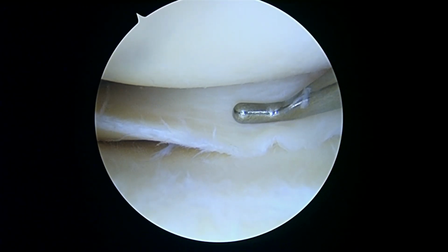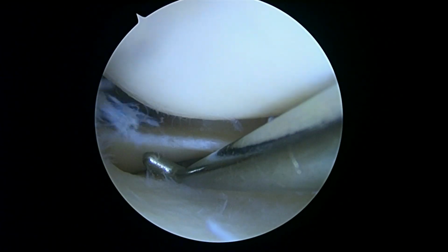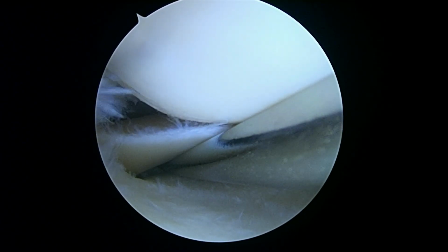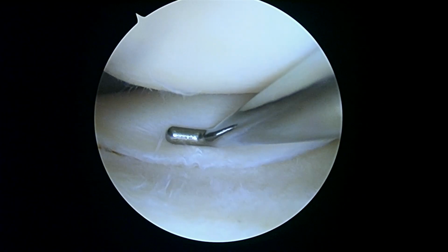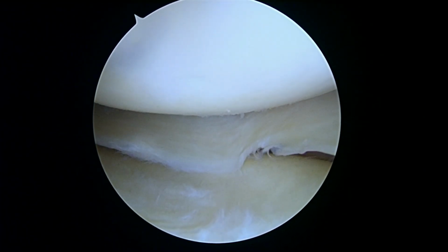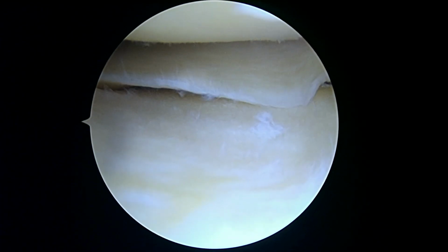Push down on the knee, please. Great. And so we can see all the way around to the root. A root tear would be way back here at the tip of the probe. The root tears need to be repaired. We can hook that, make sure you don't have a hidden root tear. You don't. And then this is the posterior horn of the medial meniscus, and other than some inner edge fraying, it looks pretty good. And so we'll take a little bit of a basket forceps and trim out the inner edge, but we really don't have to take away any significant meniscus.